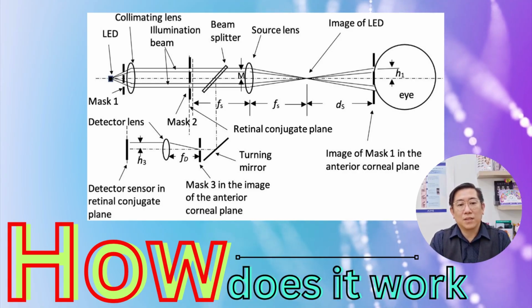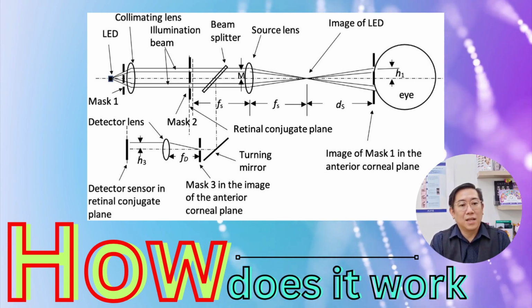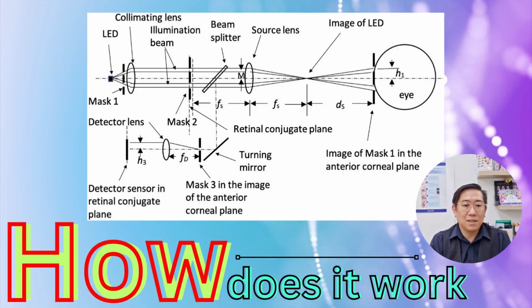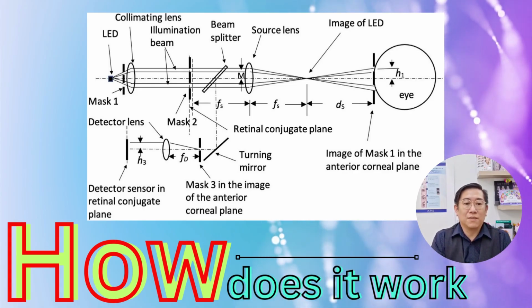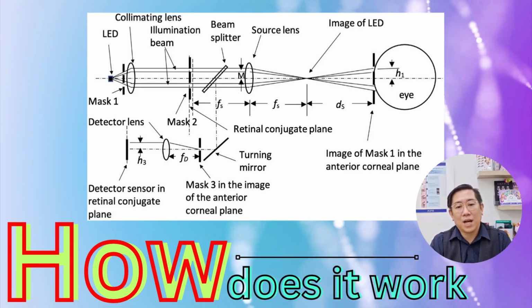To sum up, the autorefractometer is a sophisticated digital device that projects light into the eyes, detects the reflected light, analyzes how the eyes focus, and delivers accurate objective measurements. It's a fast and non-invasive tool used in almost every routine eye exam today.